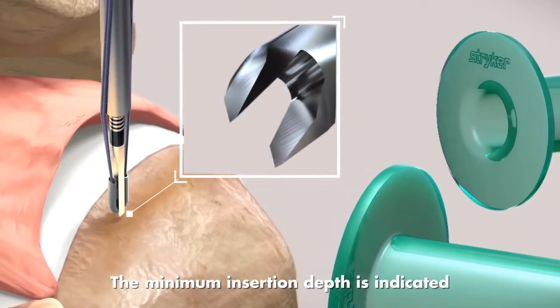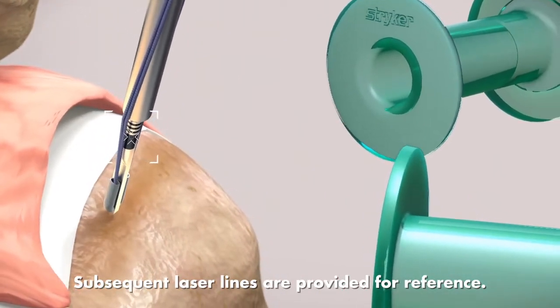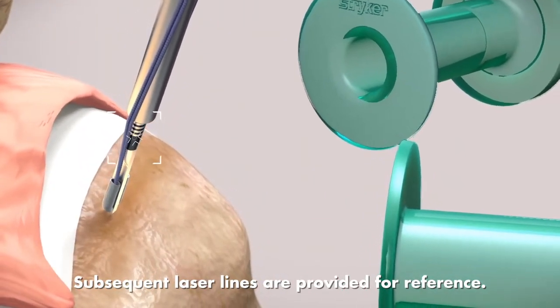The minimum insertion depth is indicated by the most distal portion of the solid black laser line. Subsequent laser lines are provided for reference.